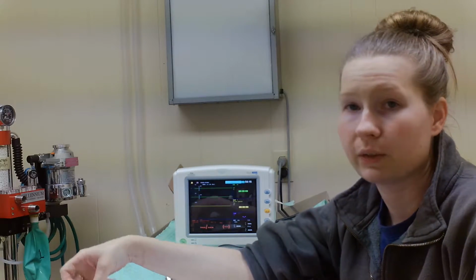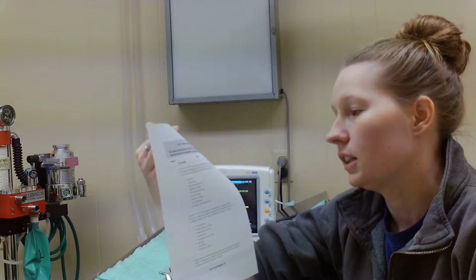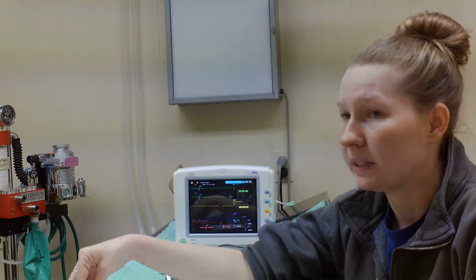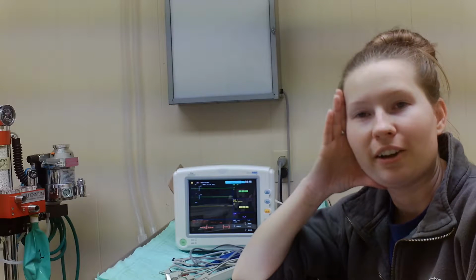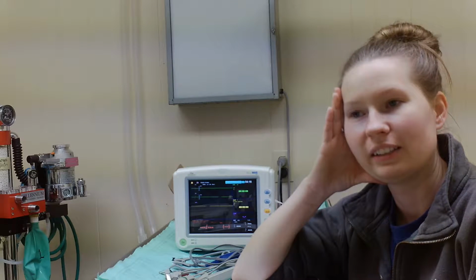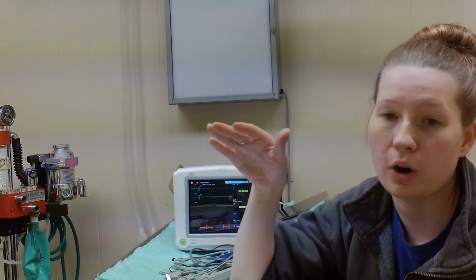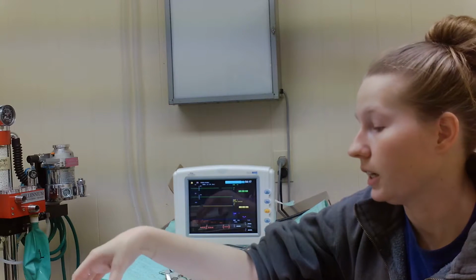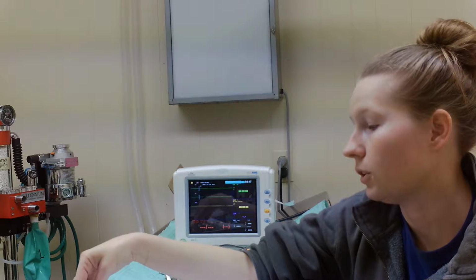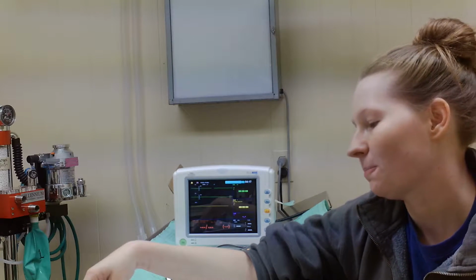The reason why it's important to know the heart rhythm is because there can be a potential for an arrhythmia or what have you. Any abnormal rhythm of the heart, anything other than a normal lub-dub sound, is not normal. So if you're hearing anything other than a lub-dub, obviously it's not normal.